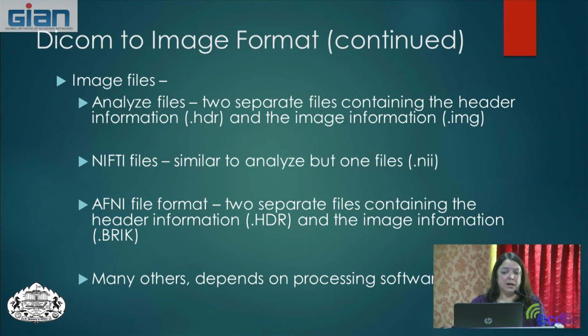If you entered a participant ID number, it contains this information, while the image information, the .img file, is basically the bulk of the image. So it's a very big file, but if you tried to read it by itself, you wouldn't have any of the information about that data. This is typically the way that fMRI data was stored for a long time.